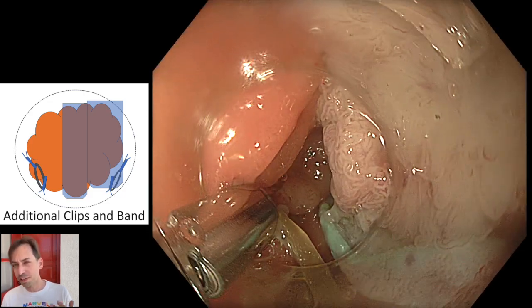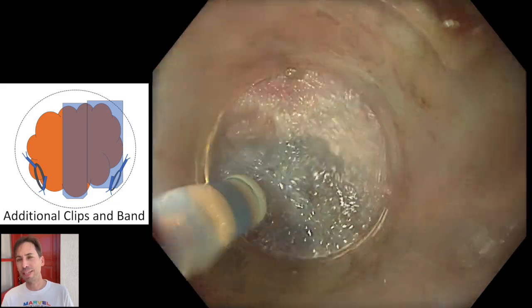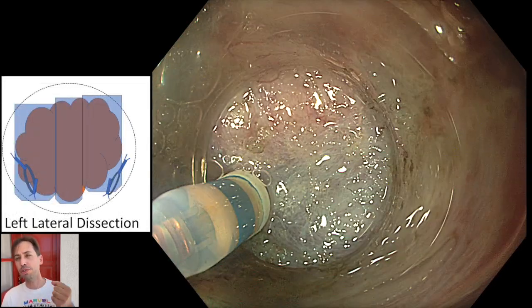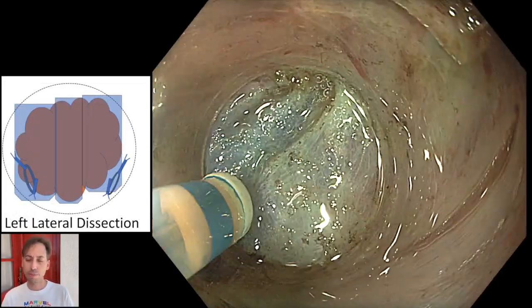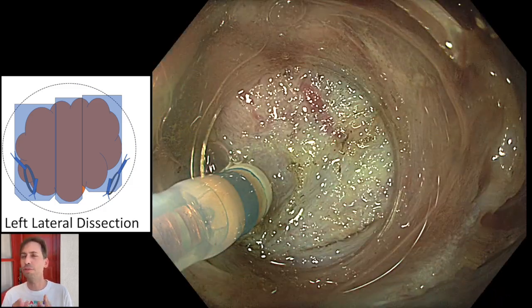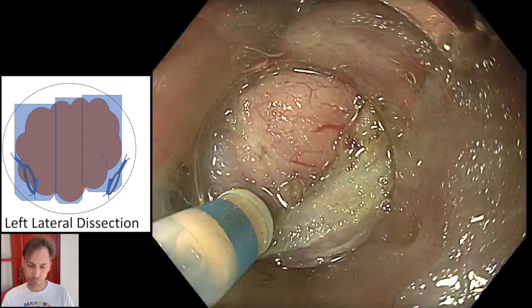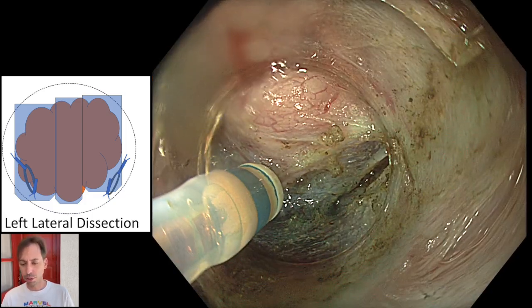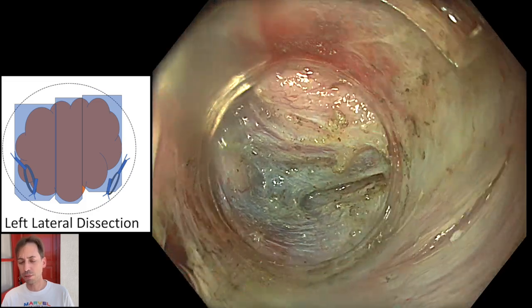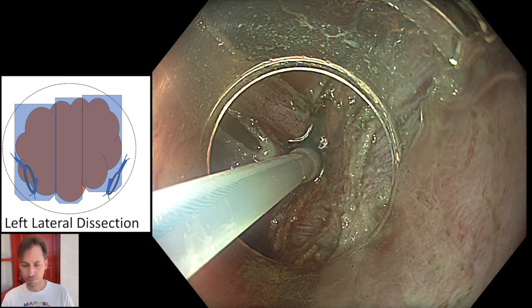Are there any disadvantages with traction? Yes. The traction can be very excessive, and it pulls the muscle, and you may provoke perforation, because while you dissect you have a lot of muscle fibers during dissection. So be careful not to perforate the muscle during this part of the procedure where you have a lot of traction.